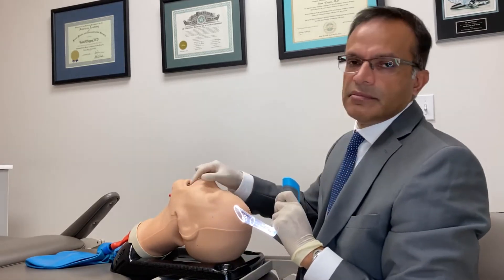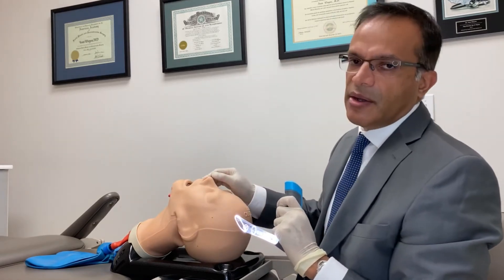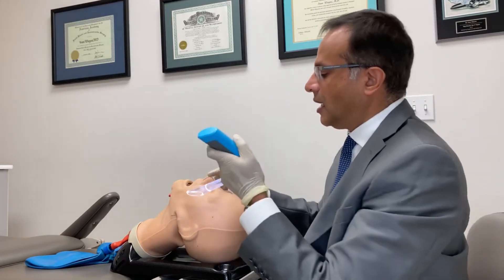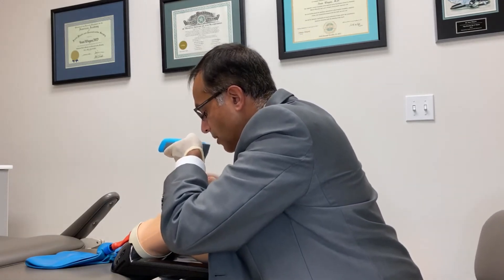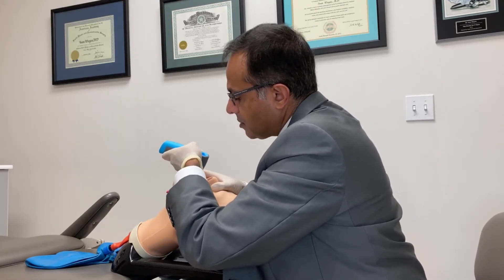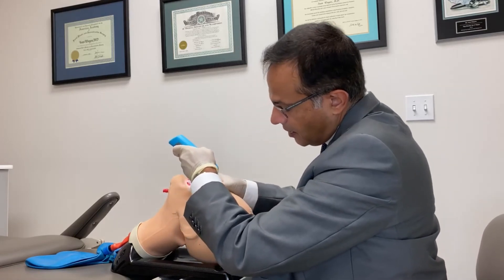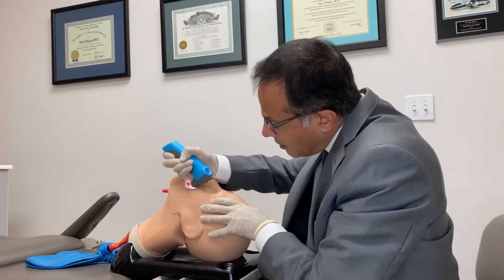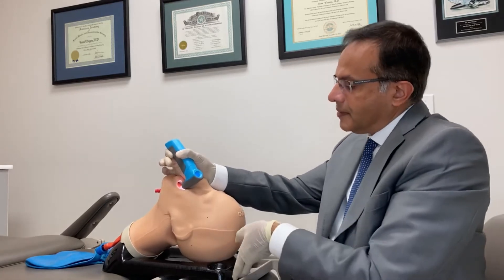What about a patient with really prominent teeth where you just can't get a view? Why not miss the teeth completely and go paraglossal? I'll go on the left side, look down as I advance, see the epiglottis, come past, see the interarytenoid notch — Tongue, Epiglottis, Notch — miss the teeth completely, and push a little further until I'm right on the vocal cords, sitting on the side.